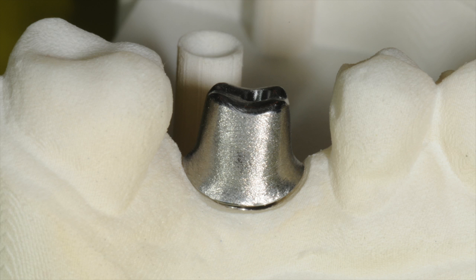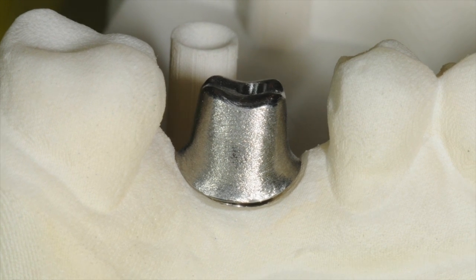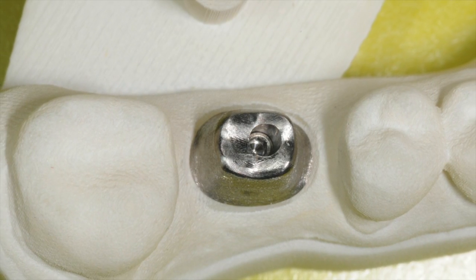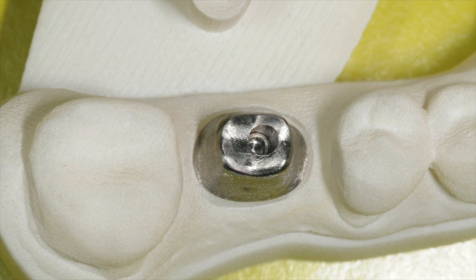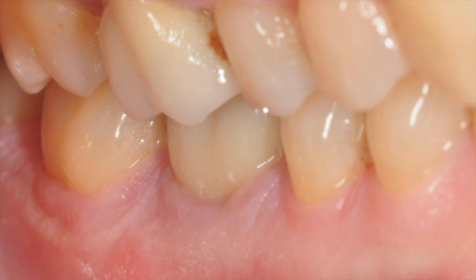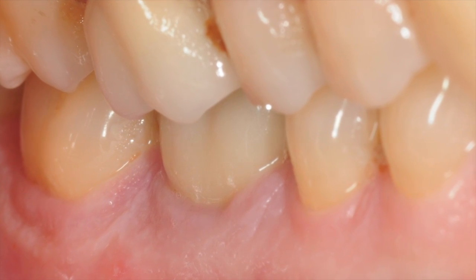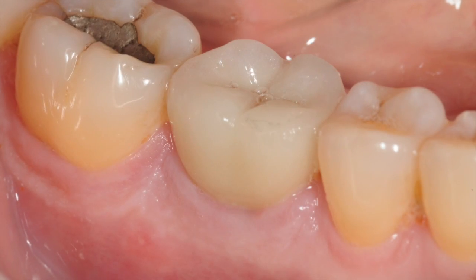Next, a CAD-CAM customized abutment is milled and delivered to the restorative dentist for insertion. At the same time, the final CAD-CAM restoration is also fabricated and placed on the custom abutment.